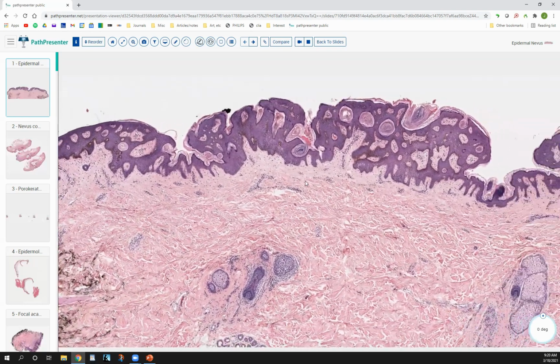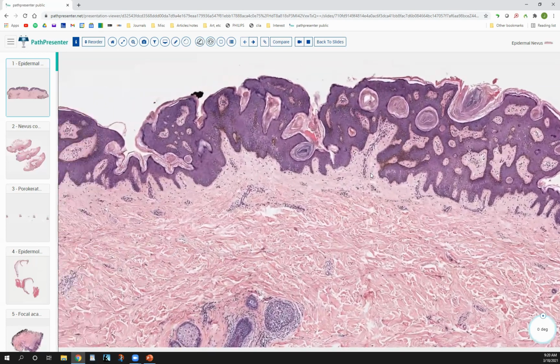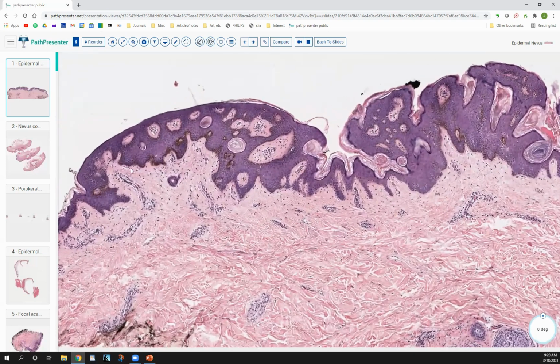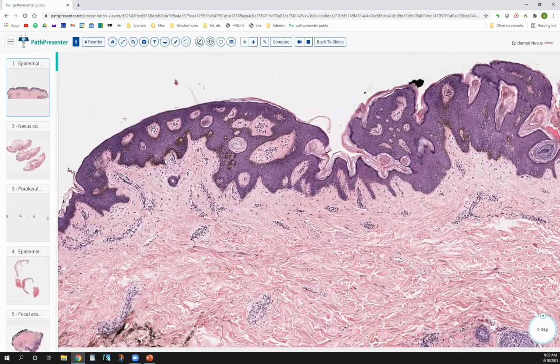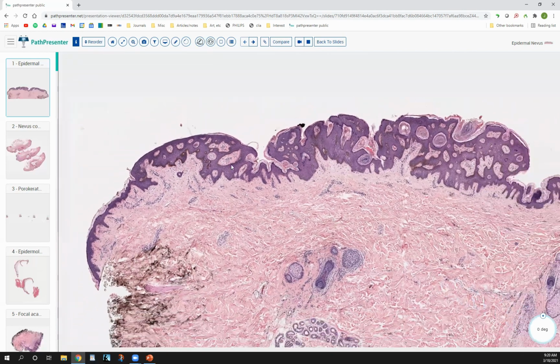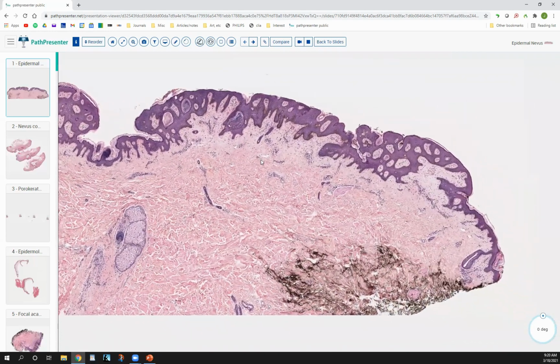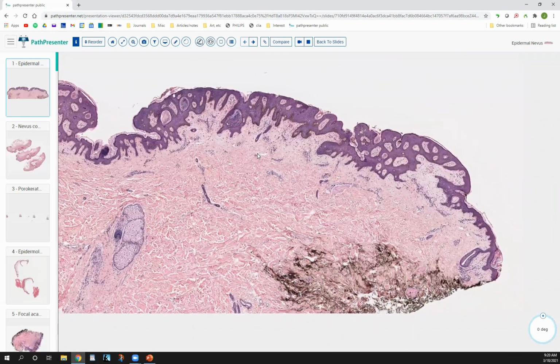One thing that I have noticed with epidermal nevi is that they often have more of a papillated appearance. You can see right here, almost like a papillomatous or even a polypoid appearance, and that's because the stroma is involved in the whole hamartomatous process. And that's one of the things that differentiates seborrheic keratosis and epidermal nevus. So it can be a handy thing to know.